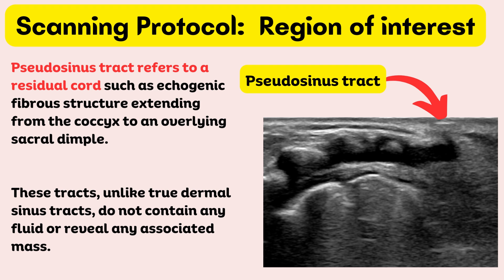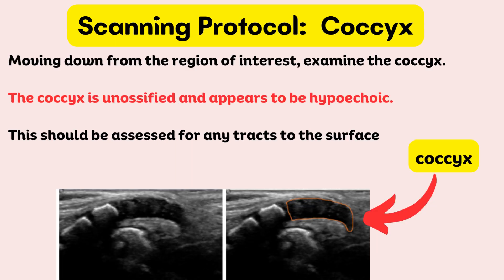Pseudosinus tract refers to a residual cord-like echogenic fibrous structure extending from the coccyx to an overlying sacral dimple. These tracts, unlike true dermal sinus tracts, do not contain any fluid or reveal any associated mass. Moving down from the region of interest, examine the coccyx. The coccyx is unossified and appears hypoechoic. This should be assessed for any tracts to the surface.